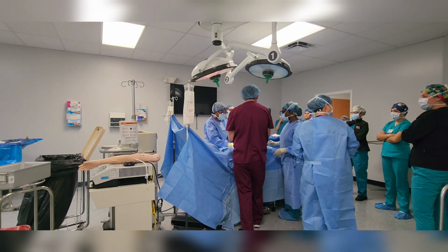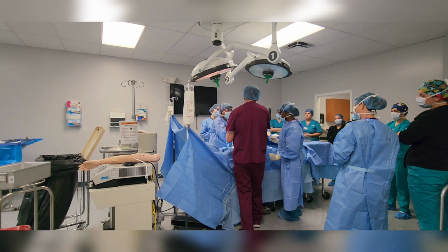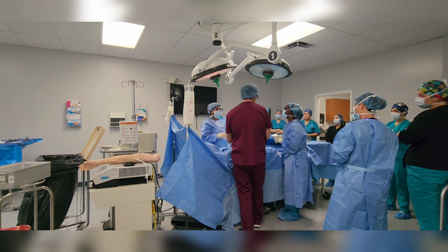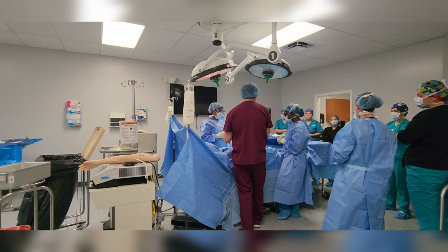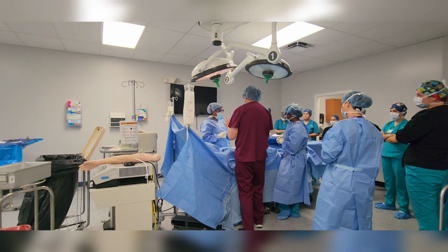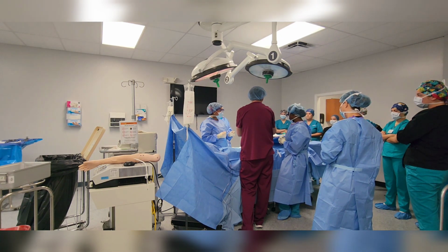So whatever you give me, I'm going to clamp, and you're going to hold onto it with your left, and I'll give you another one and clamp with your right. But when I say take it off, you take it off with one hand, because you have to have the ability to use both hands. And that's always hard. So if I say take it off, just throw it down. I won't do it like that, but just throw it down.